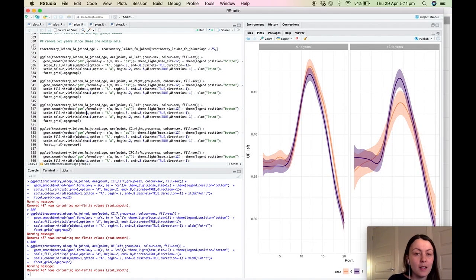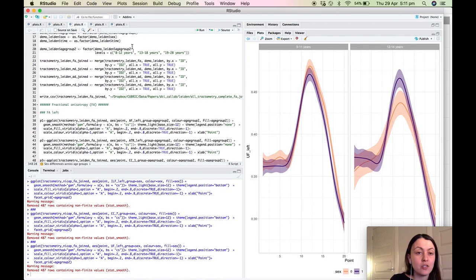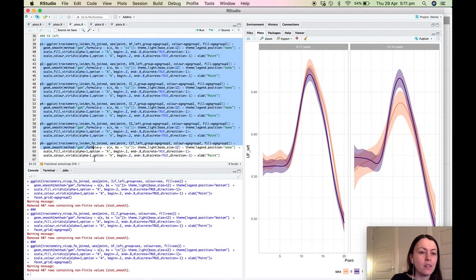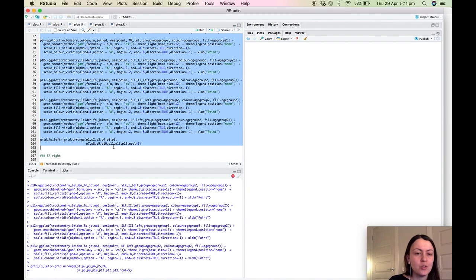Now, I'm just going to briefly mention the Leiden data as well as the Pittsburgh data, because these data sets have much larger age ranges than the other two. So these age groups here are 8 to 12, 13 to 18, and 19 to 28. And with these data, they kind of follow the expected pattern of increases with age as you get into adulthood. So I'll just show maybe one example just so we don't spend too much time on it. So just for a smaller number of tracts. And for these three separate age groups, the color gradient is similar to what we used before, where we're seeing the lighter colors are the younger age groups and the darker are the older.